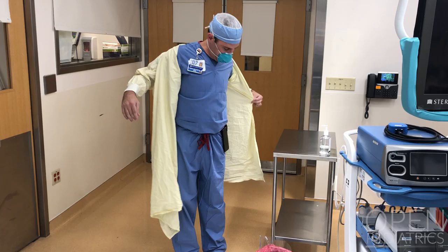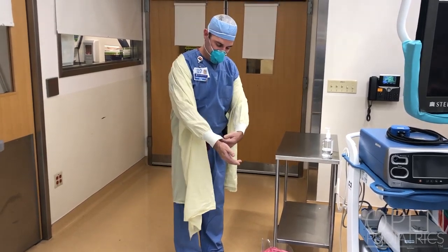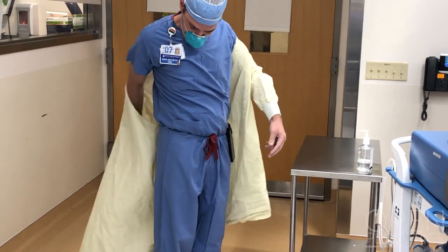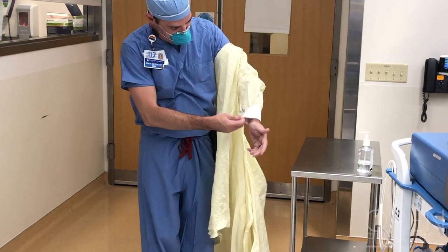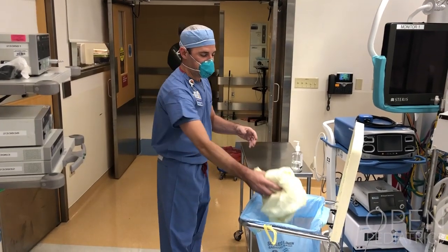Try to only slip your hand inside the clean part of the gown and one by one remove the sleeves. Without crossing my hand in front of my body, I'm able to touch the inside clean part of the gown and slip each shoulder out. Then, keeping in mind that we had clean gloves over the cuff, we can assume the cuff is clean and slip our fingers underneath to pull each arm out. Touching only the inside of the gown, collect the gown and place it in the appropriate receptacle.